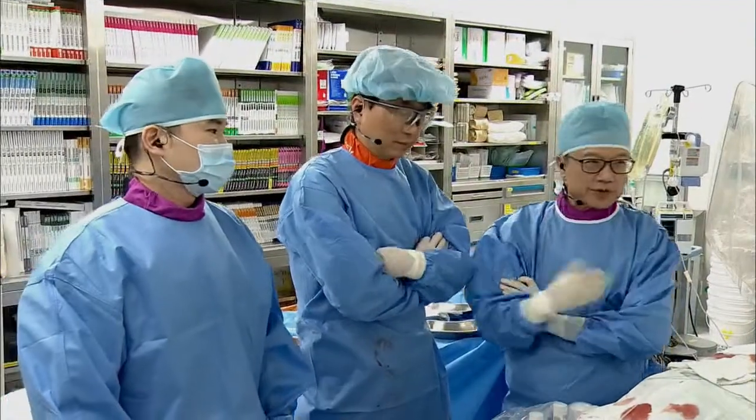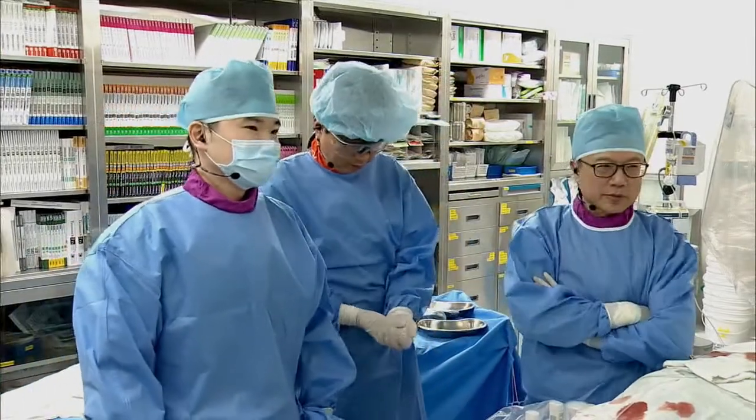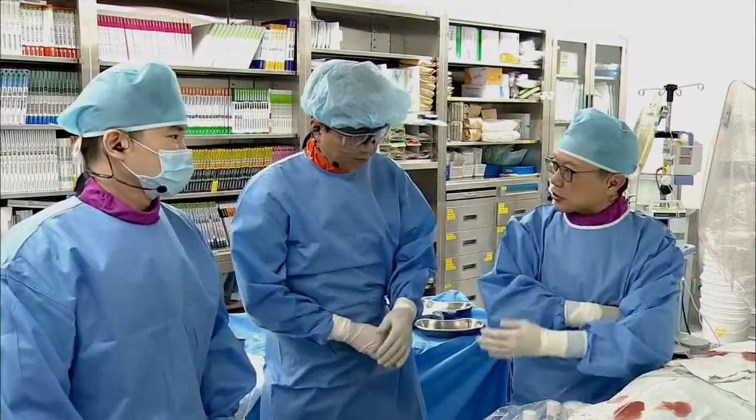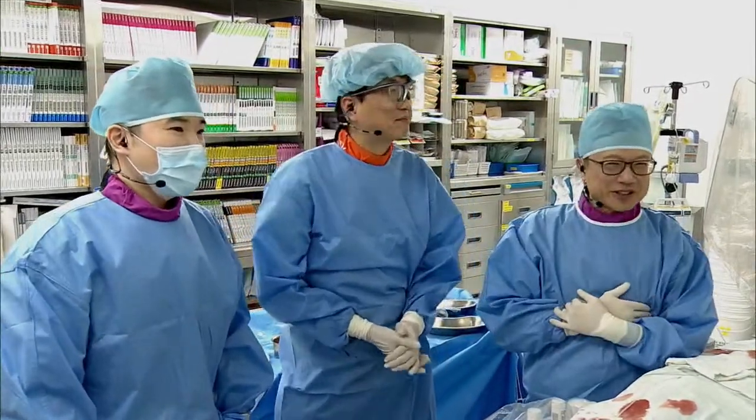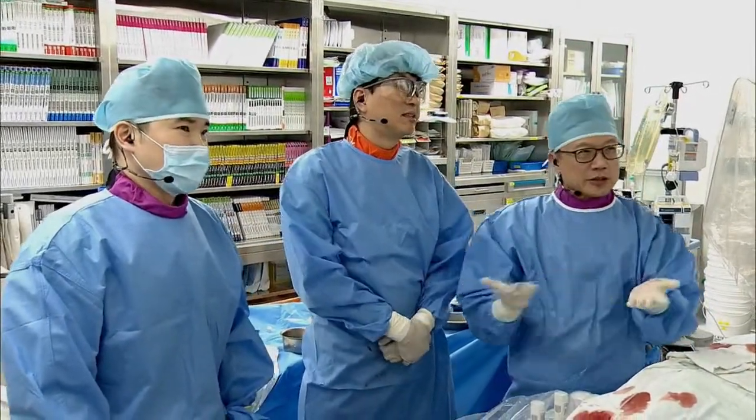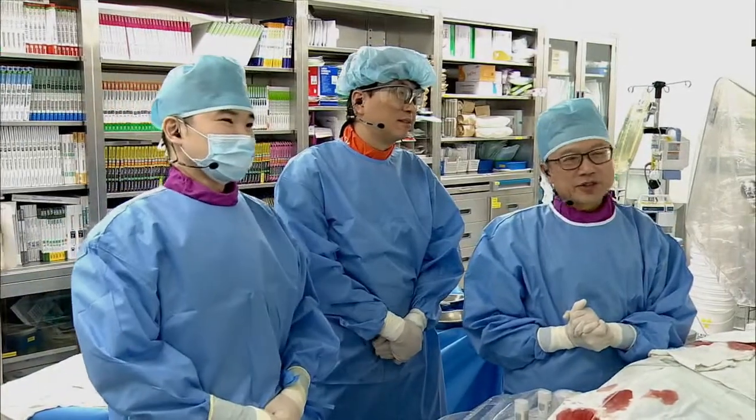I'm here today with Dr. Lee and Dr. Yun, a great team, and Dr. Lee has laid out everything already. I'm just here to help him a little bit, putting the stents in over the next few minutes. So Dr. Yun is going to tell us about the case first.